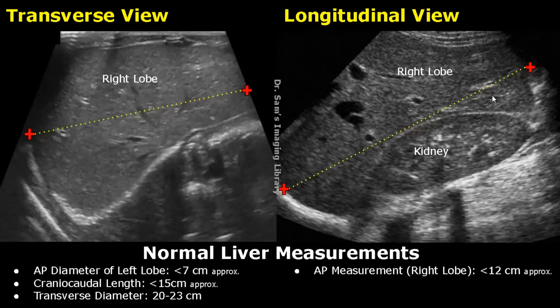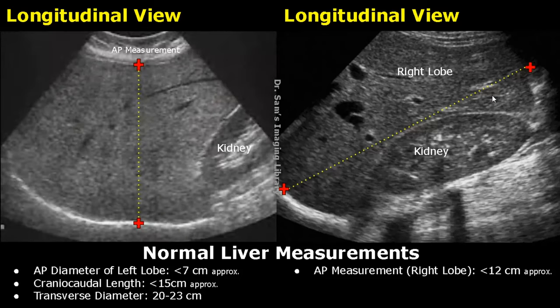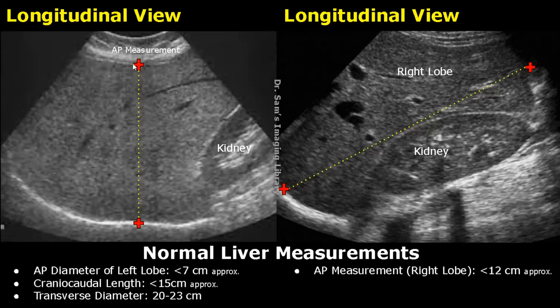This image shows us how to take the AP measurement of the right lobe. The measurement is less than 12 cm approximately. One caliper is placed at the anterior margin of the right lobe and the other caliper is placed at the posterior margin.